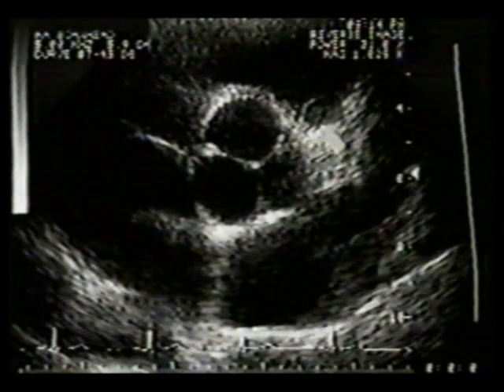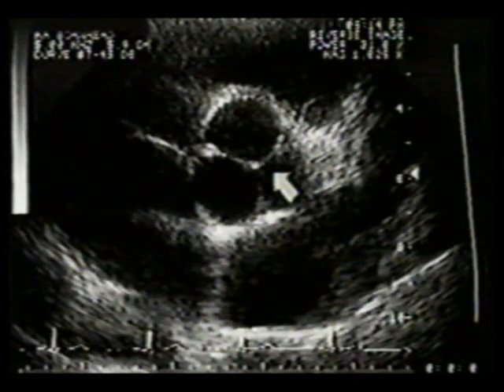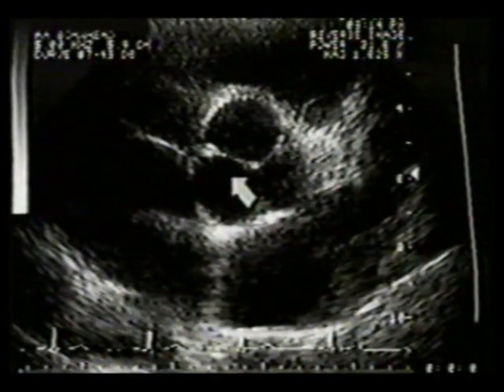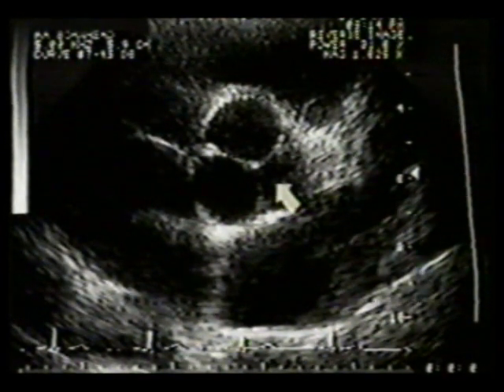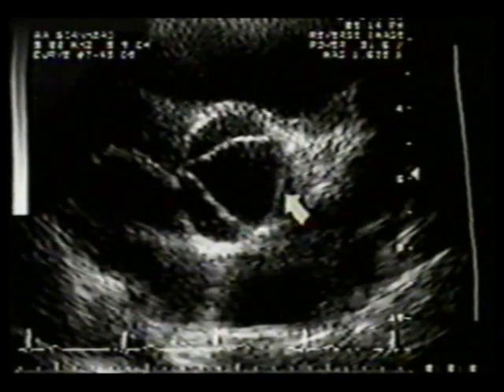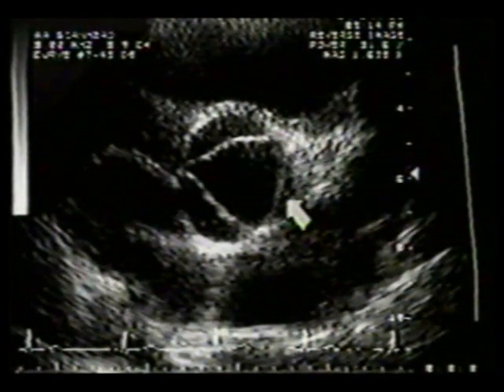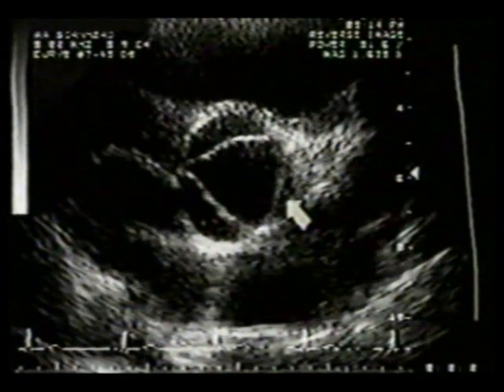In this diastolic frame, the closed aortic cusps form a Y within the aorta. The right coronary cusp is adjacent to the right ventricular outflow tract. The non-coronary cusp is adjacent to the right atrium, and the left coronary cusp is adjacent to the left atrium. In systole, the valve opens with a triangular appearance. This feature is crucial in differentiating this normal 3-cusped valve from a bicuspid valve. Pay attention to this feature in slow time.